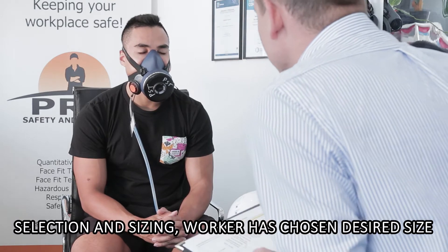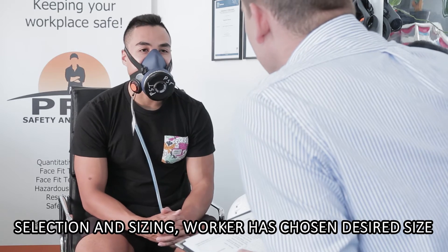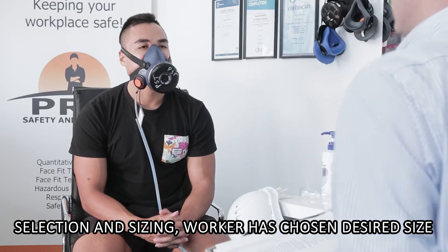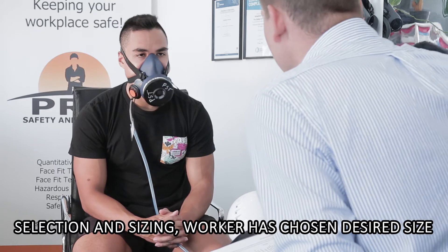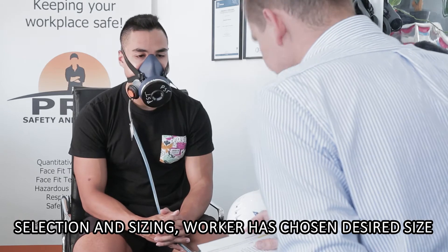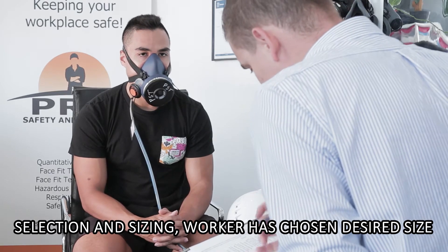Selection sizing — are you happy with a medium-large? Have you tried a small, medium, or large extra-large before? Yes, I have. And how do you find those masks — too big, too small? So the medium-large feels fine. We've also measured your face from your eye to the bottom of your chin — that's between 112 and 125mm, which is what Sundstrom recommends for a medium-large. So if you find that comfortable, we're happy with the sizing. That's been done prior to the fit test, so I'm happy with selection sizing.